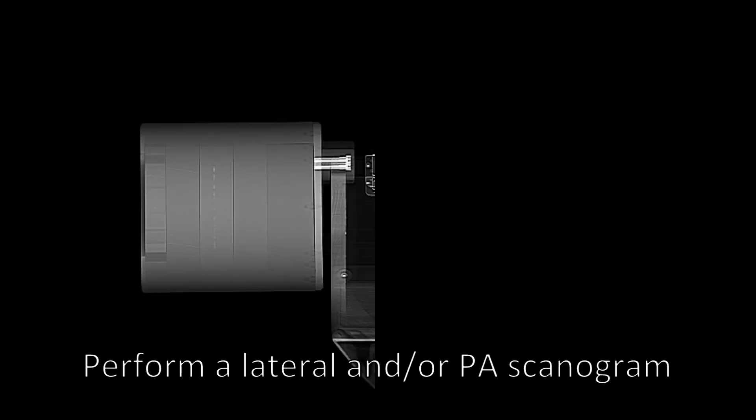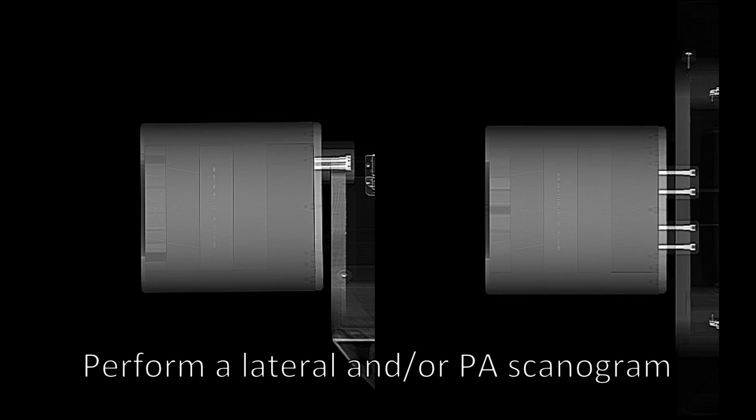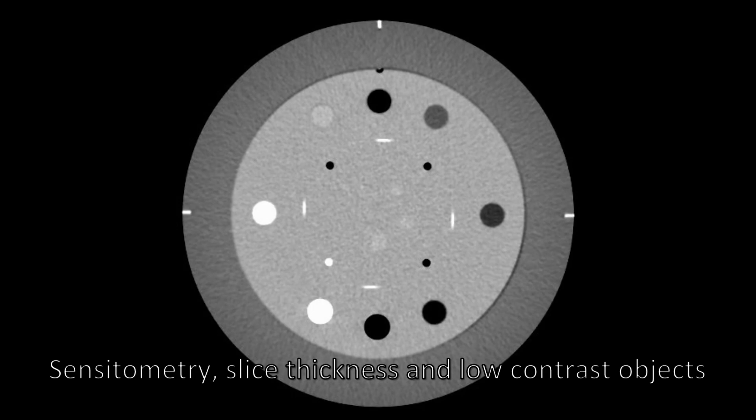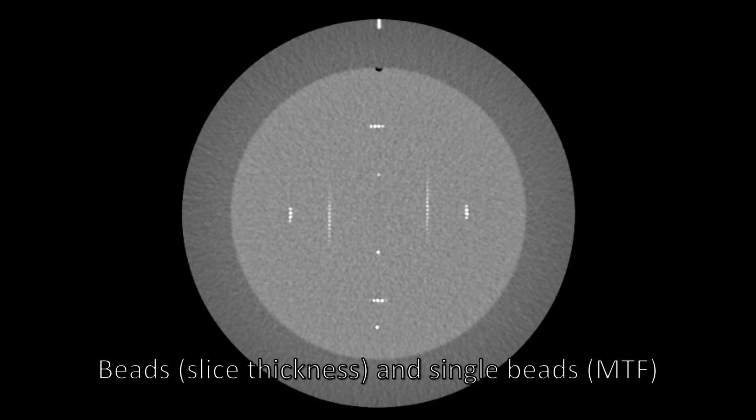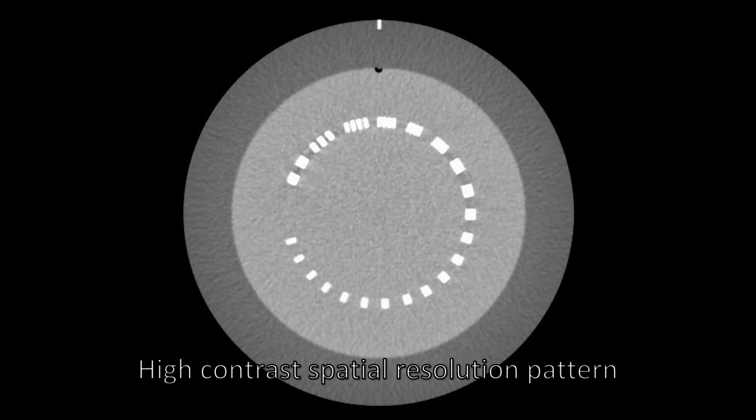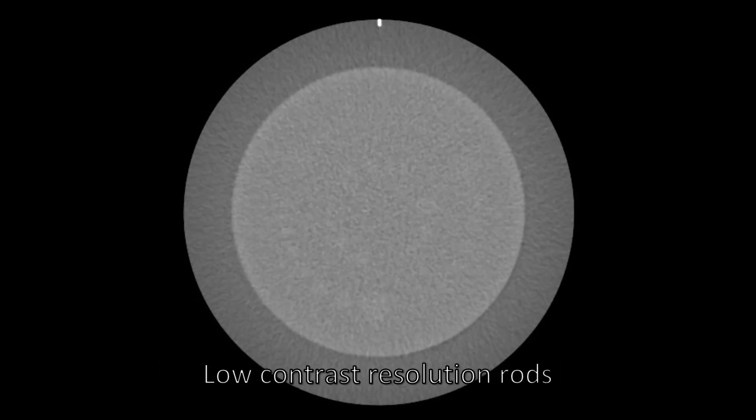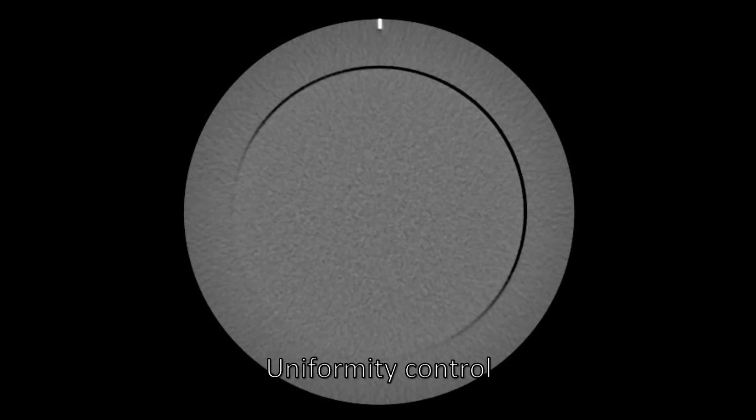Perform a lateral and or posterior anterior scanogram. Let us describe the CATFAN 600 modules. Each module center is marked with a white marker: Sensitometry, slice thickness and low contrast objects, beads for slice thickness and single beads for modulation transfer function, high contrast spatial resolution pattern, low contrast resolution rods and uniformity control.